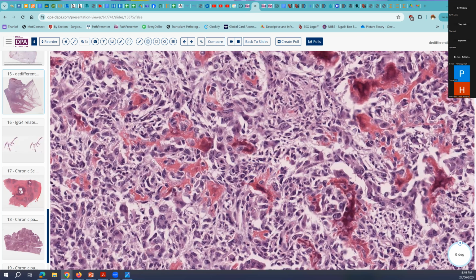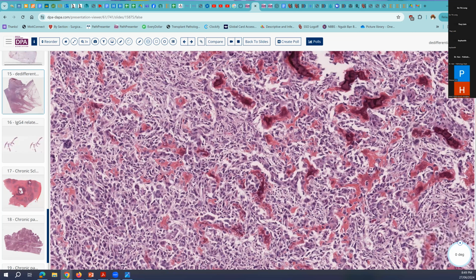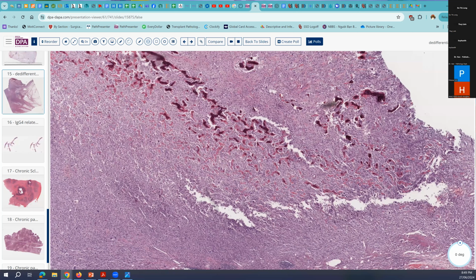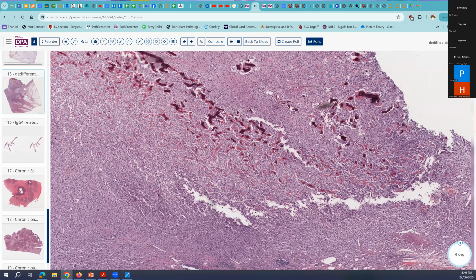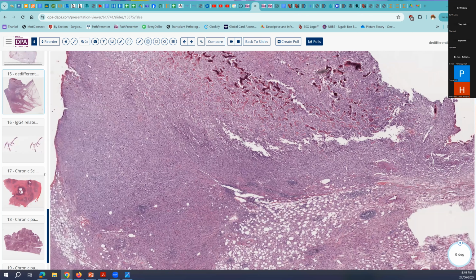So, we wouldn't call this extraosseous osteosarcoma in this setting because we have this gradation from well-differentiated liposarcoma to dedifferentiated with heterologous elements. We also know, of course, that there are some osteosarcomas that do have MDM2 mutation, though they're usually not the high-grade pleomorphic variety, as we're seeing here. So just a very interesting differential and progression of disease.